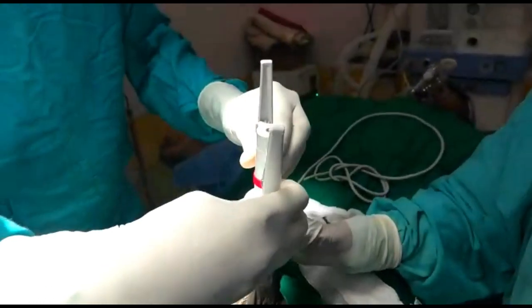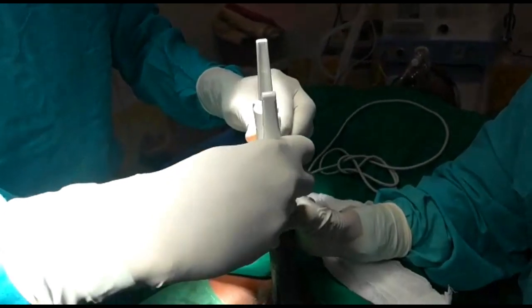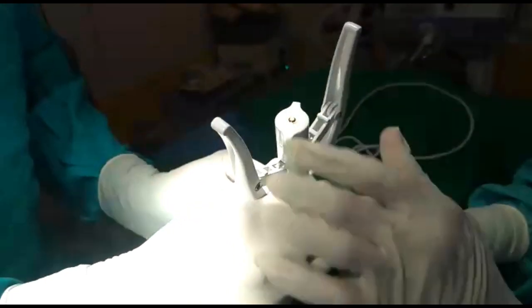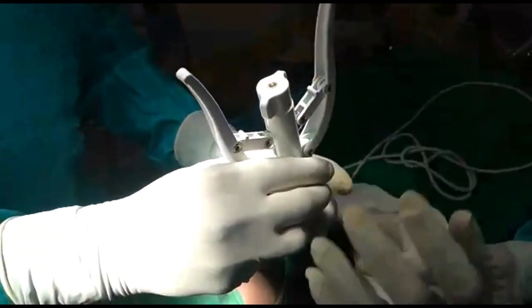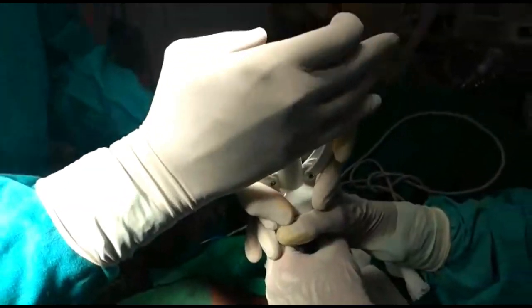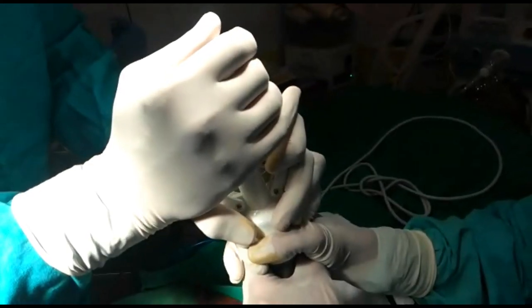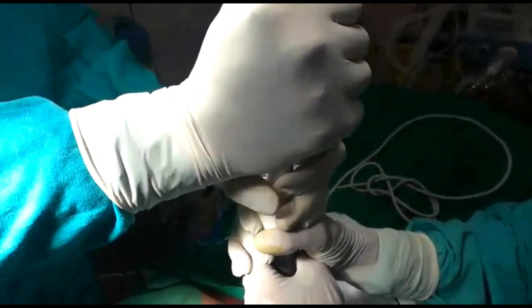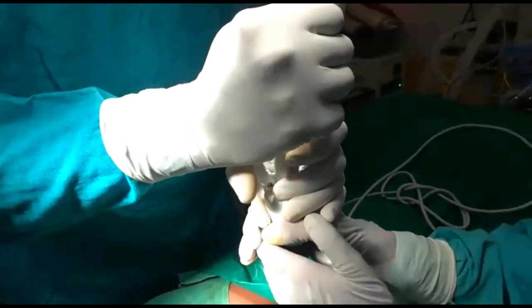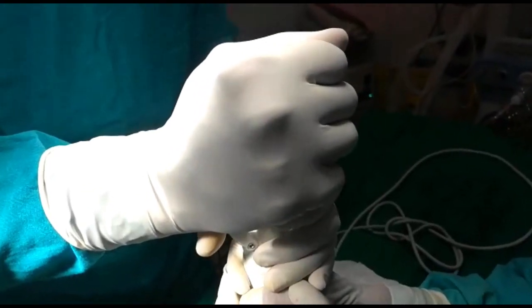This is a protective device which needs to be taken off before the procedure is done, so that comes off like that. Now I am going to go ahead and engage this, close it — this is all nice and tight. I start compressing these two hands together. I just need to ensure that this comes in nicely. This is quite smooth — you see that I have completely compressed it, and I am going to hold this in place for about 45 seconds to about a minute.